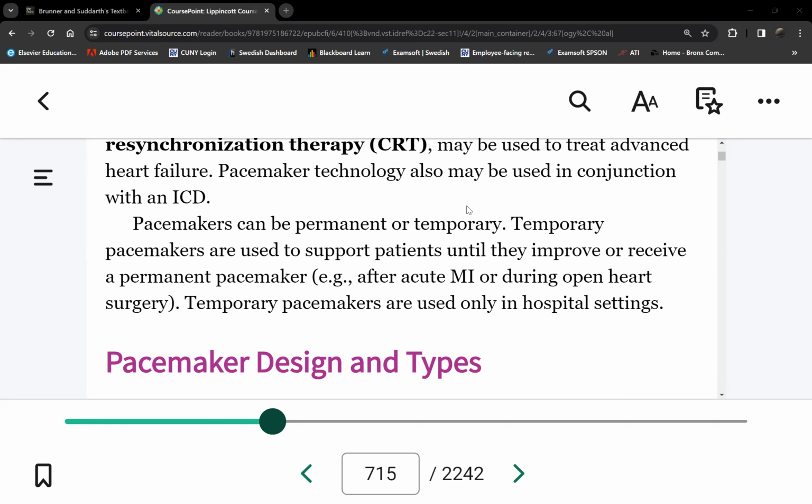Voila, we have a temporary pacemaker. That can stay on for a few hours, maybe 8 hours, until the next morning. At the next business hour, the cardiologist, the cardiothoracic surgeon comes in and puts in a permanent pacemaker in her.